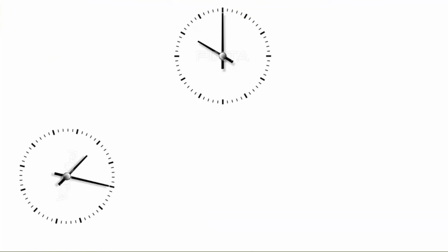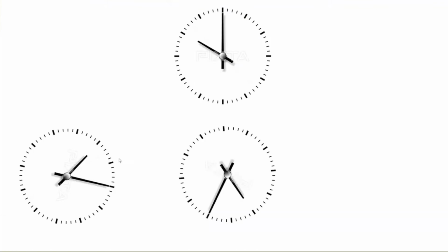If your flexible endoscope is oriented neutrally and looking at this clock, then certainly you will also see 10 o'clock. If you rotate the scope and just turn it clockwise, then that same image in your mind is obviously going to read the time as 2:20. If you rotate that endoscope further clockwise, then even though the patient's anatomy hasn't changed, the view that you're looking through with the endoscope has now switched further to 5:40 in this case.